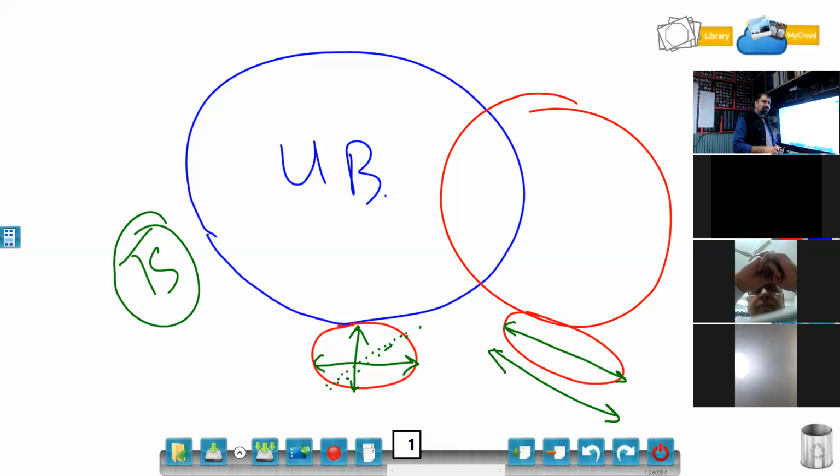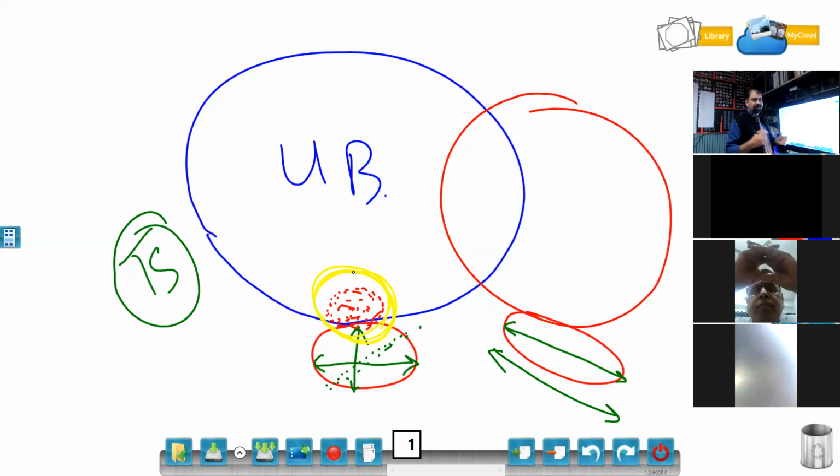And from this prostate, what you have to see in benign hypertrophy of prostate is any medial lobe hypertrophy. If there is any medial lobe hypertrophy, that will be bulging in the UB, and you have to measure this median lobe separately, and you have to report it. You have to give it in the report that the median lobe is measuring this much.